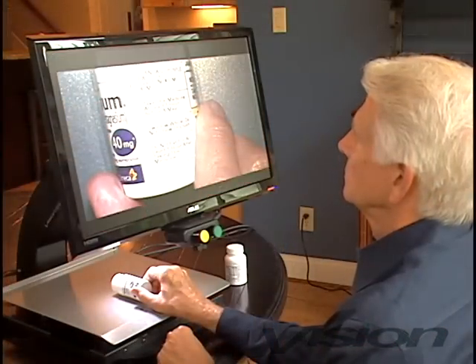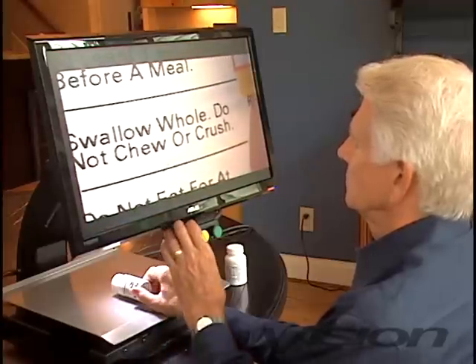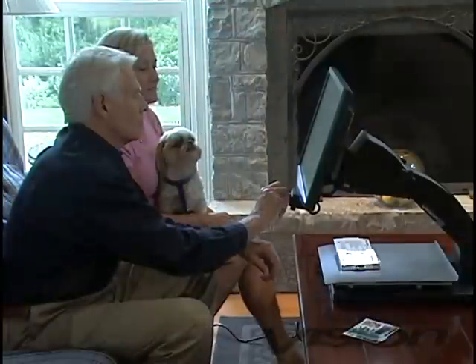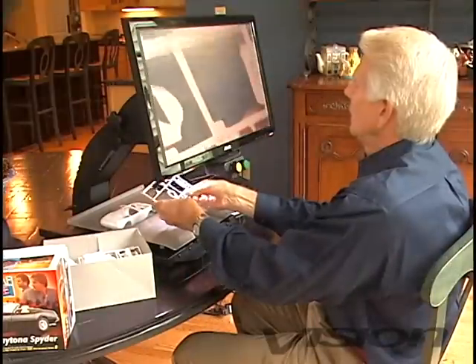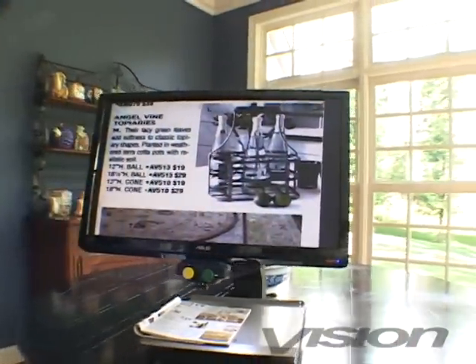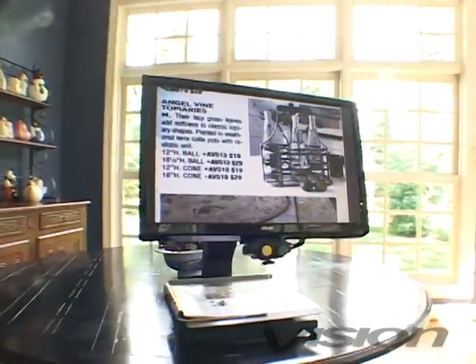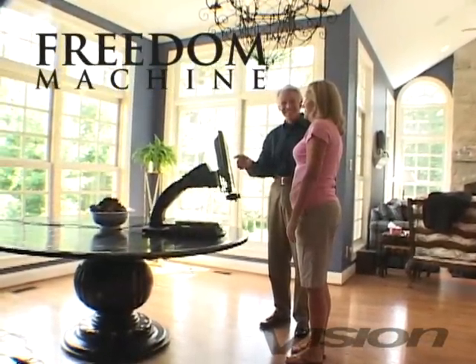Medications can be taken correctly by magnifying the prescription or instructions to a size that's readable. Magnify pet medications and make sure your pet stays healthy. Freedom Machine can help bring back independence and happiness. Vision Technology's Freedom Machine has helped thousands of individuals with low vision live independently.